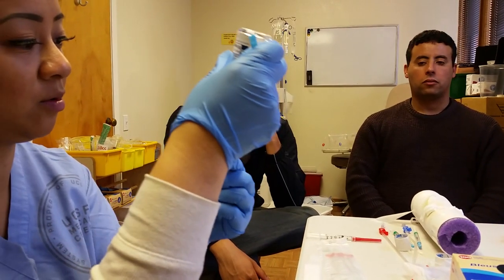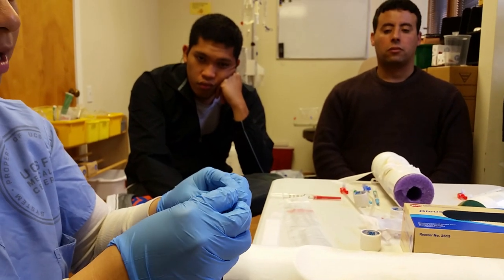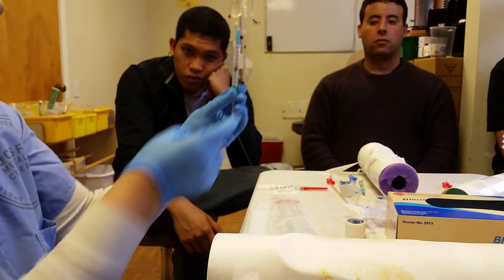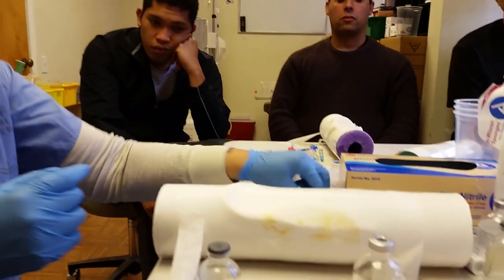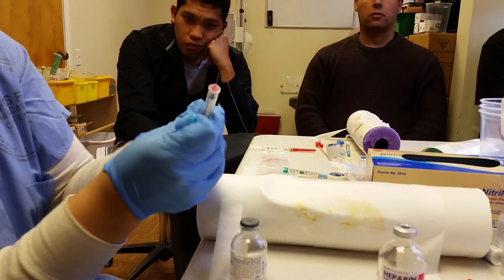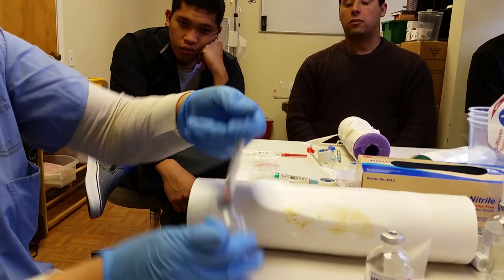I normally try to get as much air as I can out. Clean the top again. Put the other needle in. Pull back point five. Pull it back in. Push the air in.